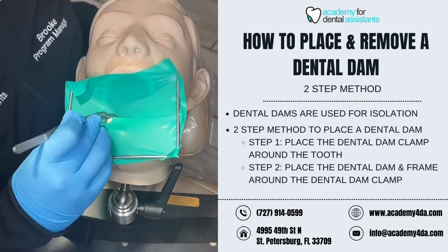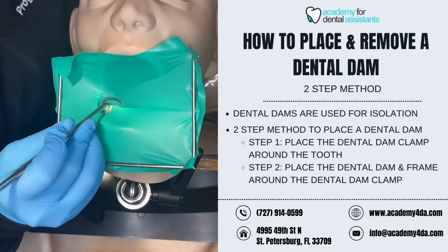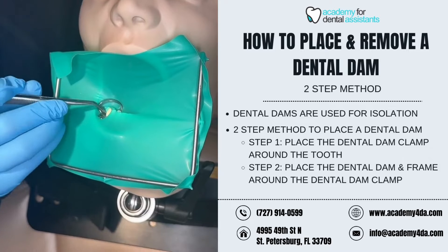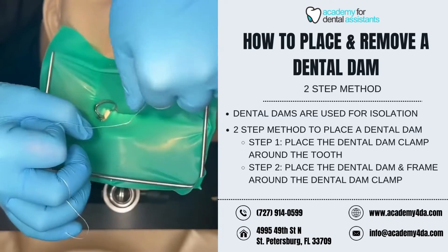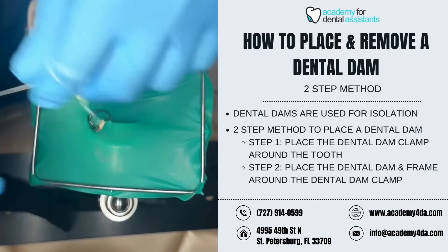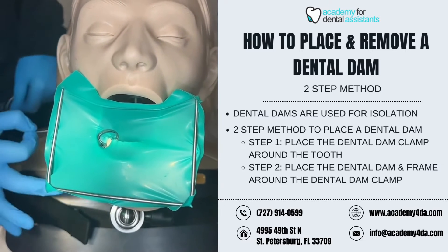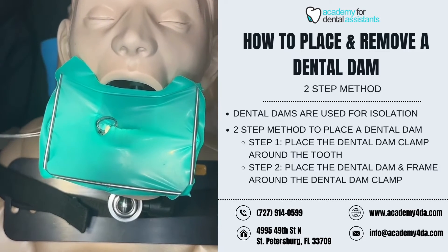Now I'm going to use my cotton pliers to help pull forward my dental dam to isolate it to just our working tooth. Once that's covered, I'm going to grab my floss and floss the mesial and distal contacts of the teeth so that the tooth is fully isolated. I want to make sure my ligature is coming out of the mouth so that, in case the dental dam were to pop off and go down the patient's throat, the dentist or dental assistant can quickly pull it to retrieve it.